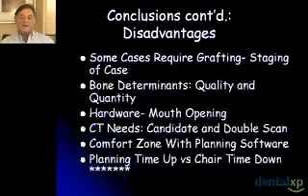The chair time goes way down, especially for me as a surgical colleague, and our restorative teammates appreciate knowing in advance where their abutments are going to end up and what type of prosthesis can be planned initially.